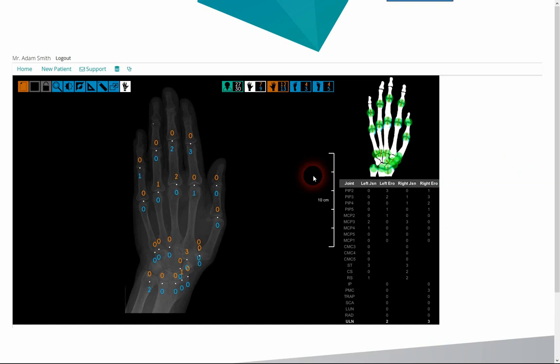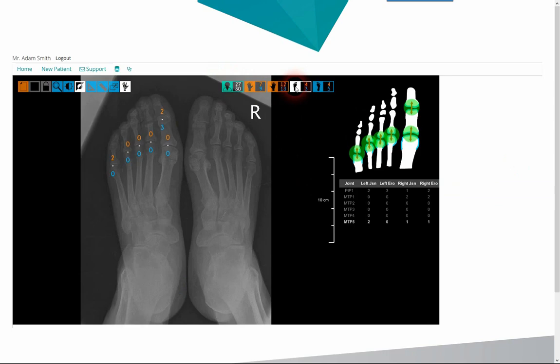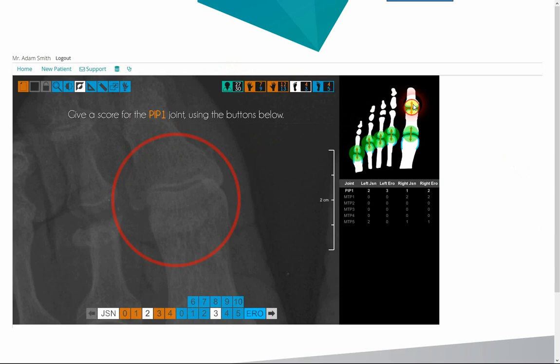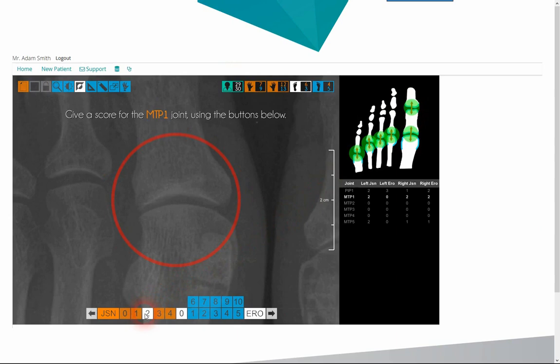At the top row, we can see that the image contains feet as well as hands, and we can quickly check the summary score previously given. Clicking the icon for single limbs, all the scores for all the joints can be reviewed. By clicking single joints, the software will zoom on the selected joint and the applicable scores can be modified.